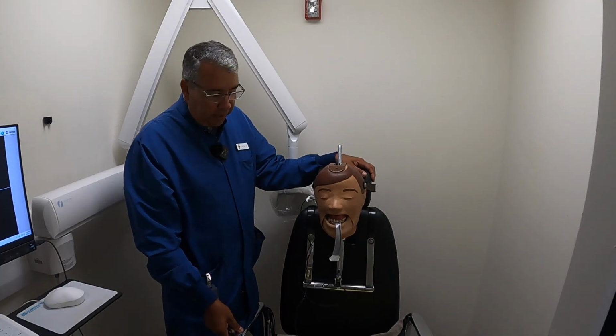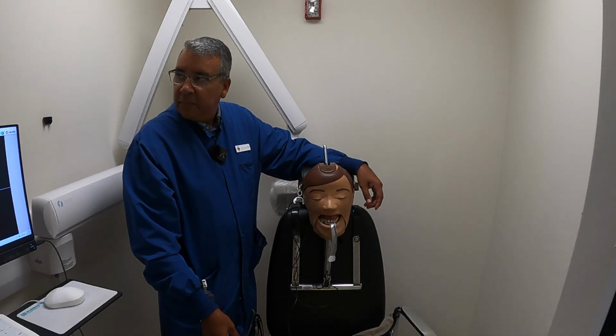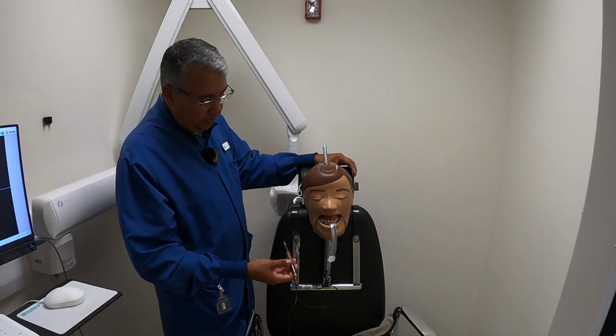Okay, so I'm going to point this towards the camera just a little bit, and then I'll show you what that looks like for these purposes. Okay, so I'm going to go back to the premolar for a second.